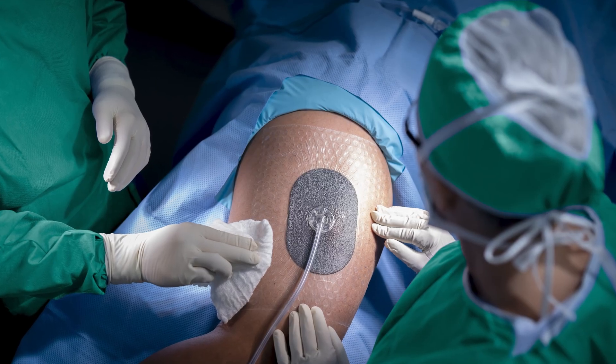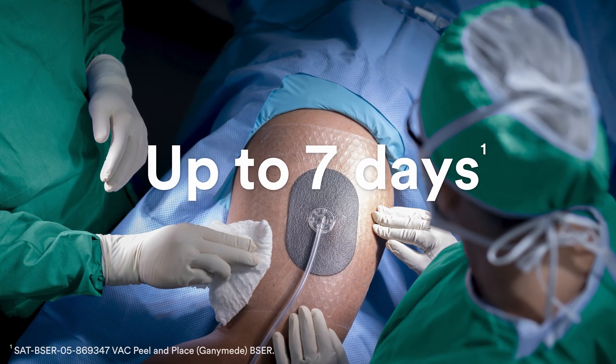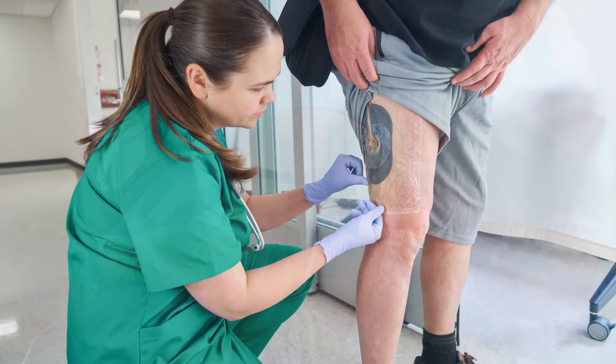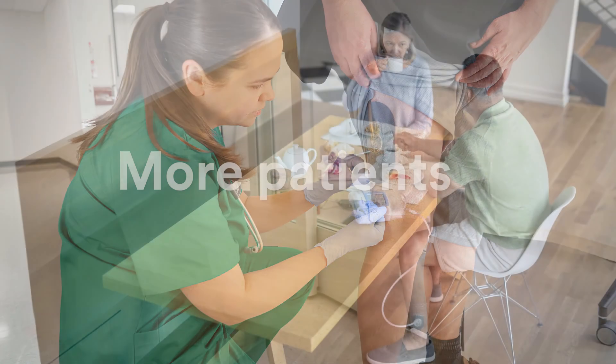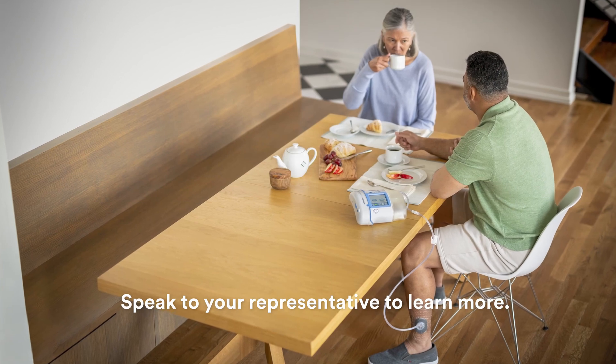VAC Peel-in-Place dressing now provides up to seven days of uninterrupted VAC therapy. We're helping to make VAC therapy more accessible to more patients and across more care settings than ever before.